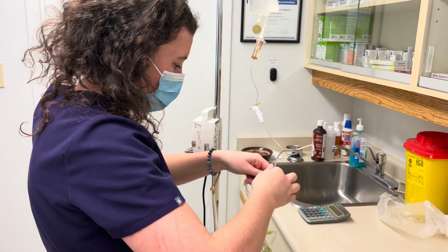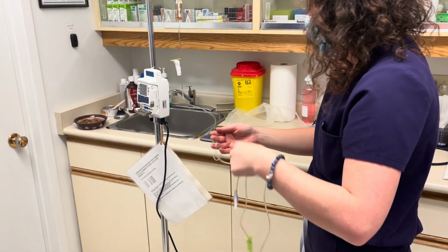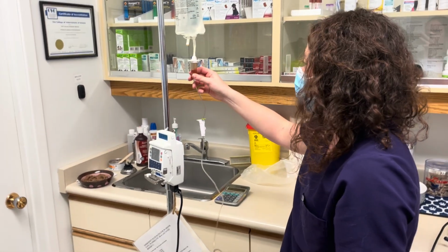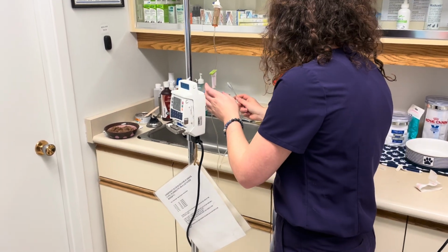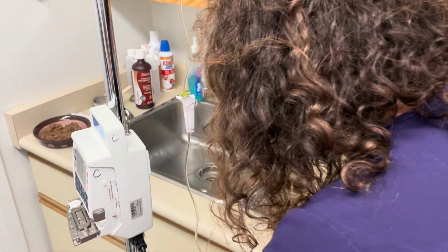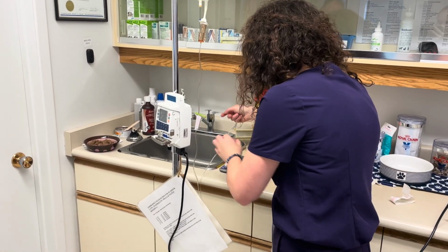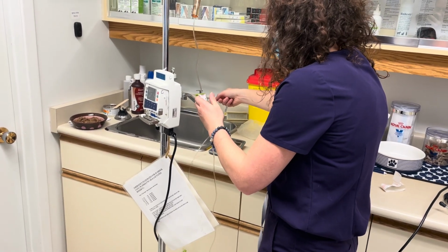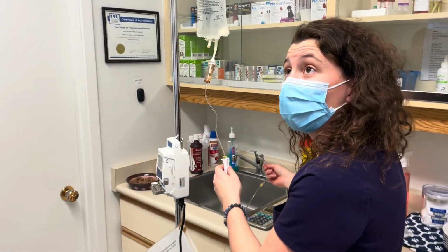Okay, so now what we need to do is we need to make sure that there is no crimps in the line, and we're making sure here that everything else is not clipped on, and we're going to prime our line now. So we've got enough fluid in here now, so I don't really need to pump that anymore. And now I'm going to fully release this and put this in the sink, just like this, and just fully release. So this is going to allow for all the bubbles, if there are any, to run directly through my tubing. And I don't have any more bubbles here, but if I did, I'd flip them, of course. Now I'm going to turn this off. Now, what I want to do is I'm going to wait until the timer goes to the 12 there, and I'm going to count for 15 seconds how many drips I get.